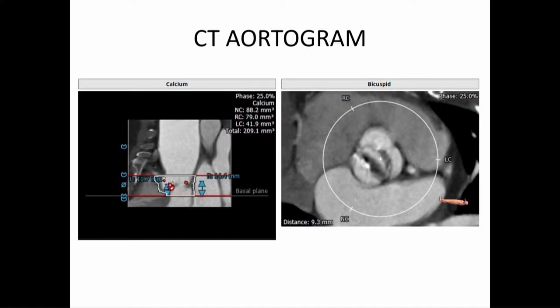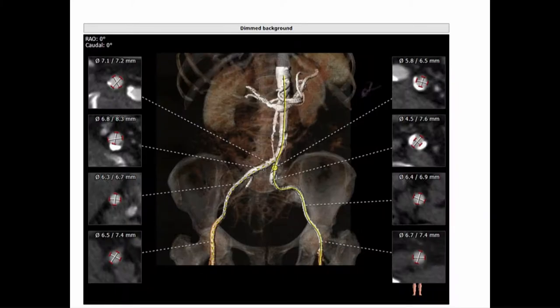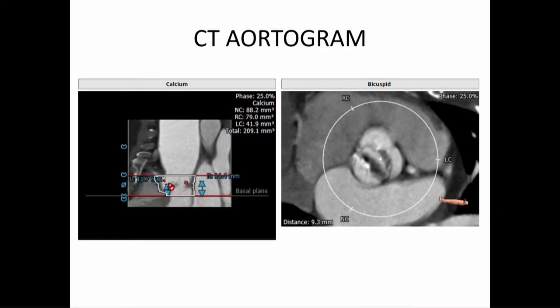The coronary heights were a little bit low. Left coronary, we got around 12, but the STJ was tall, around 16. Sorry, the sinus width, which was in the earlier slide, was around 26.